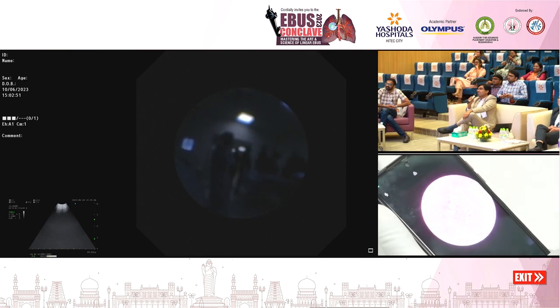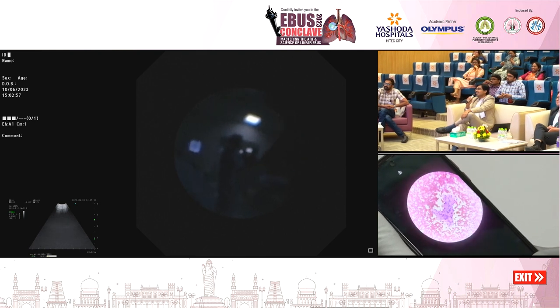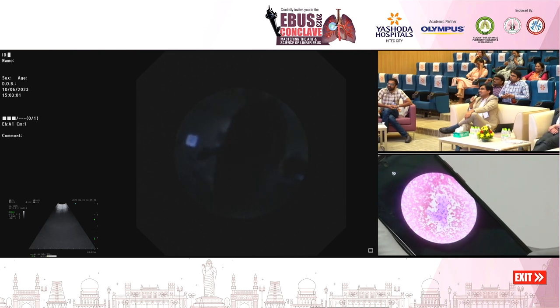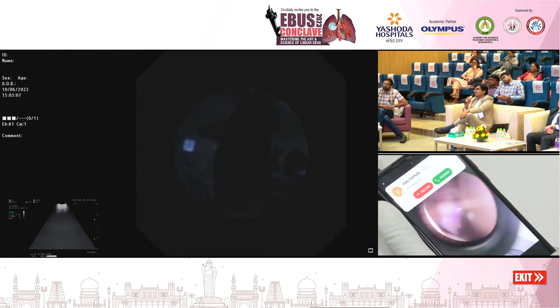Madam, what we are seeing, is it the granuloma? Yeah, this is a granuloma. It is showing a syncytium of cells suspended in an eosinophilic background. That is, the cytoplasm has coalesced together and these cells are actually round to oval to slipper shaped at places. So this is a granuloma for sure.